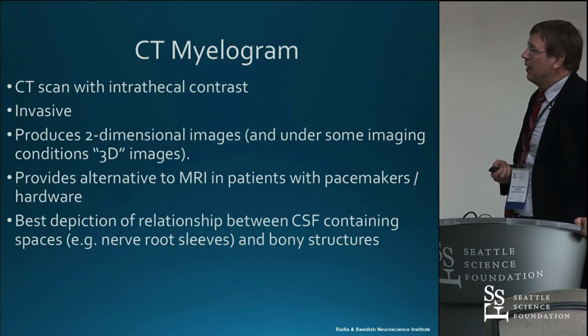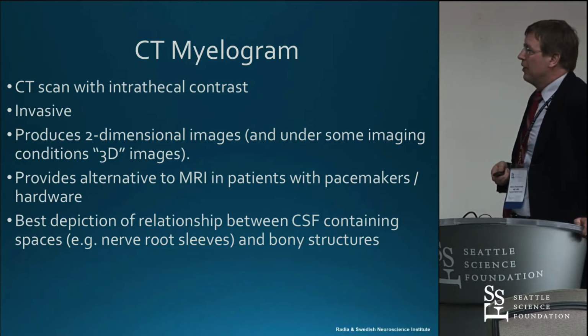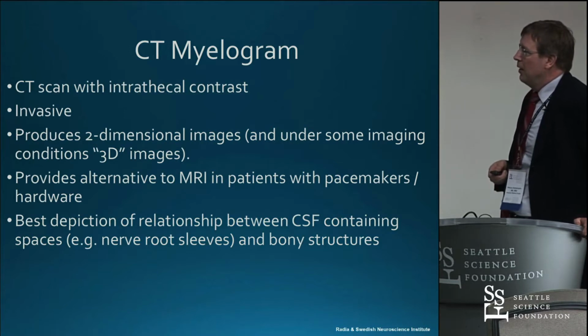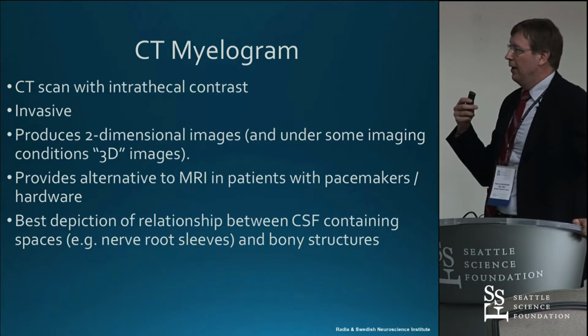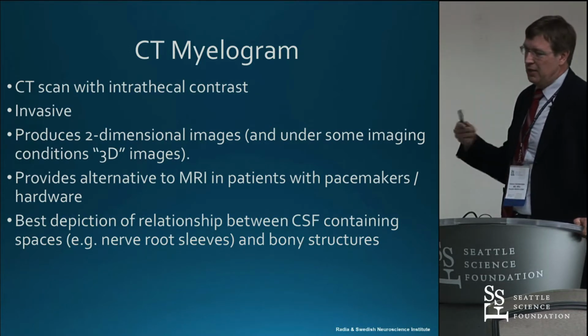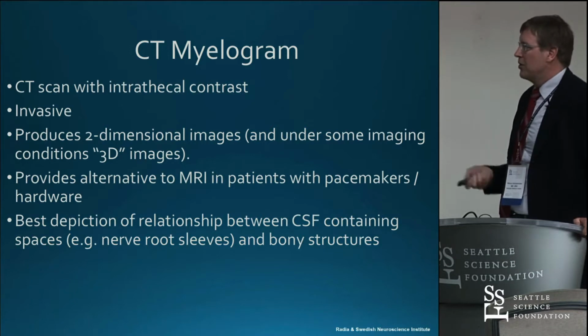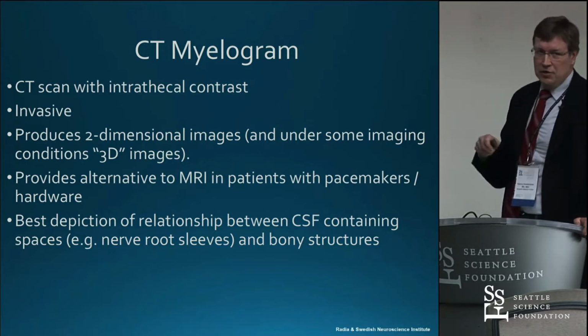CT myelogram is an invasive study. We need to get contrast into the intrathecal CSF space. It's similar to CT, but it's very good for showing you the relationship between the CSF-containing spaces, because that's where the contrast is, and bony structures. Also an alternative to MRI if the patient can't have one.